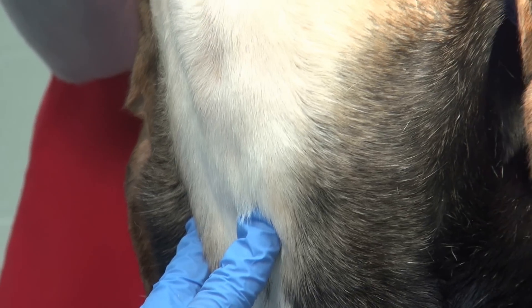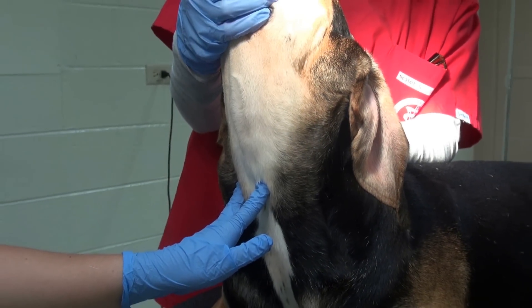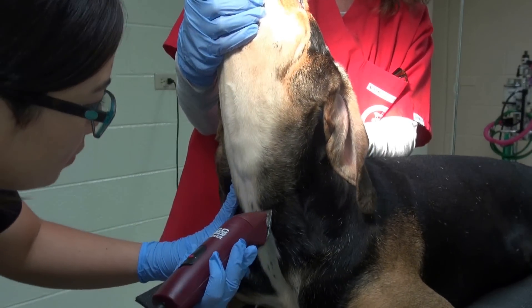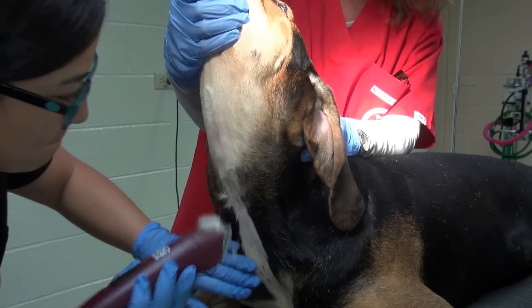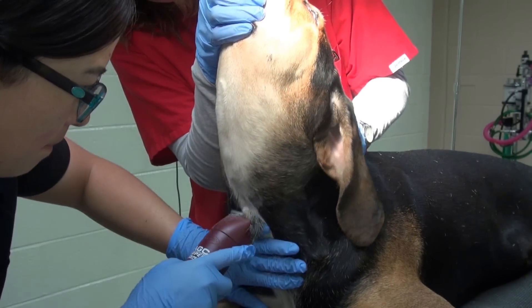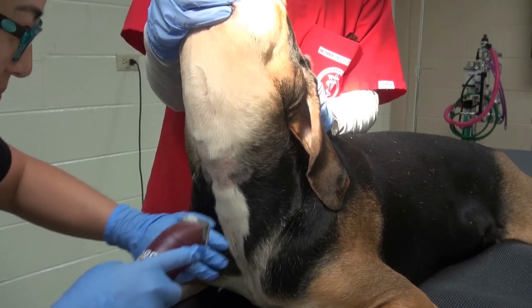Position the dog in sternal recumbency, then palpate the trachea and work your finger up to the cricoid ligament at the base of the larynx — this will be the location to center the clip. Remember to clip carefully and keep the blade of the clipper as flat and parallel to the skin as possible. Note that in this demonstration the clipper is being held at a slight angle, which will have consequences later as you'll see.